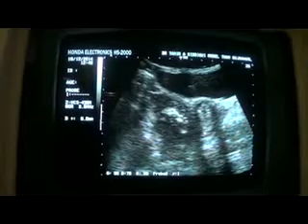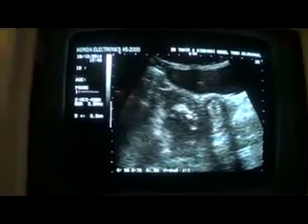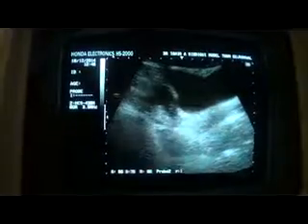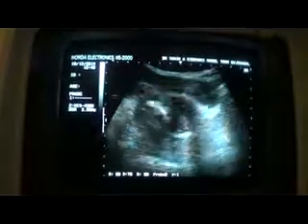and we did see the endometrial canal. We did see the ovary, and the ovary is seen. This is the ovary with a dominant follicle in it, and the right ovary is clearly visualized.